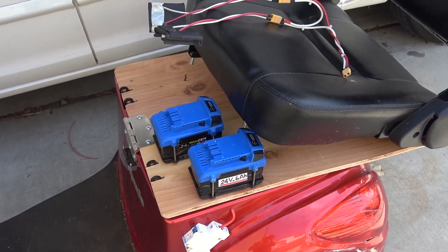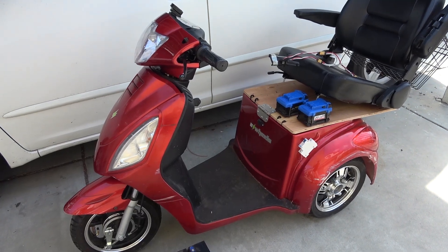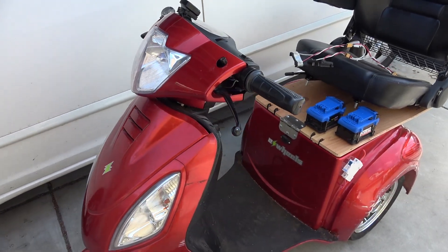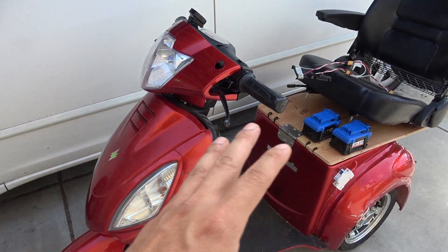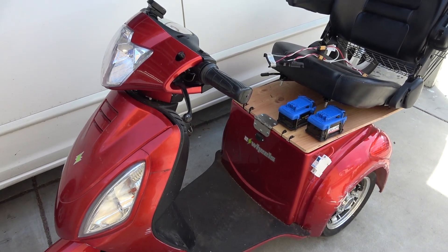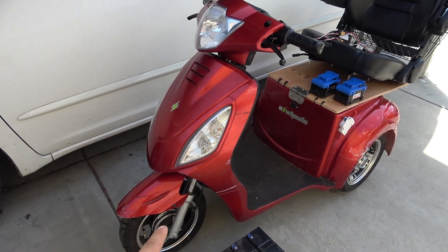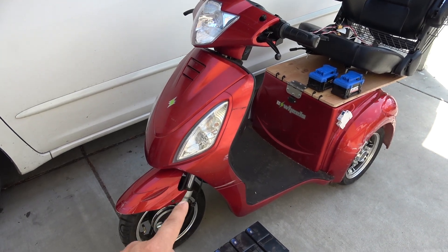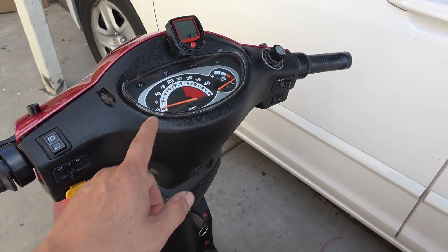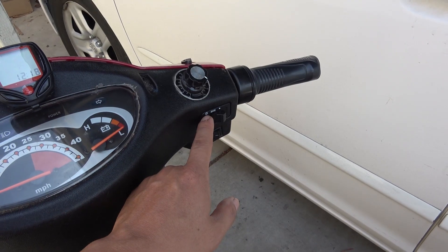Is it gonna work? Let's find out. But first let me give you a quick tour around this scooter. This is one of the most expensive mobility scooters on the market — it has all the bells and whistles just like a small car and it costs a whopping $3,000. It has a front headlight, left and right turn signal, front brake, front suspension, hydraulic rear brake, horn, speedometer, fuel gauge, and speed control.